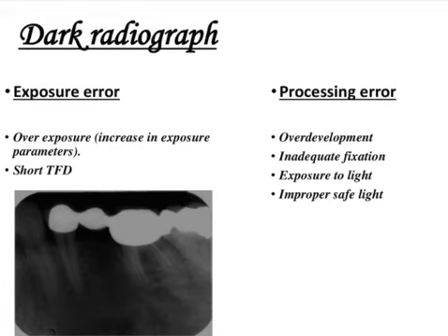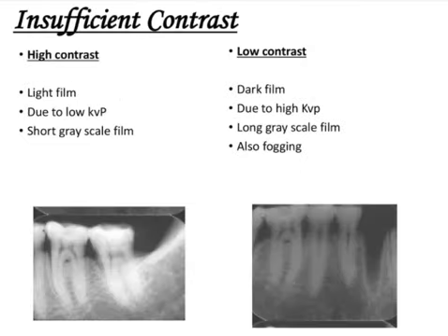If you see the image or outline of the coin on the film, that means the dark room is not light proof. There are light leaks inside the dark room. So the coin test or penny test is one of the tests which you use to check the safe lighting inside the dark room. Always remember, if light leakages are there, the films can turn foggy, they can get exposed, making them more dark.